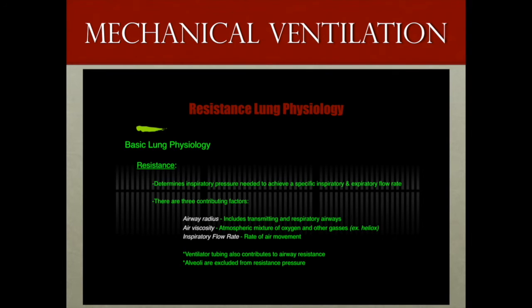Most patients are breathing room air or room air with a mixture of varying degrees of oxygen up to 100% oxygen. The difference in viscosities between room air, the various levels of admixture, and 100% oxygen is negligible. This only really becomes important in patients who have severe asthma, such that the airway resistance is very extreme.